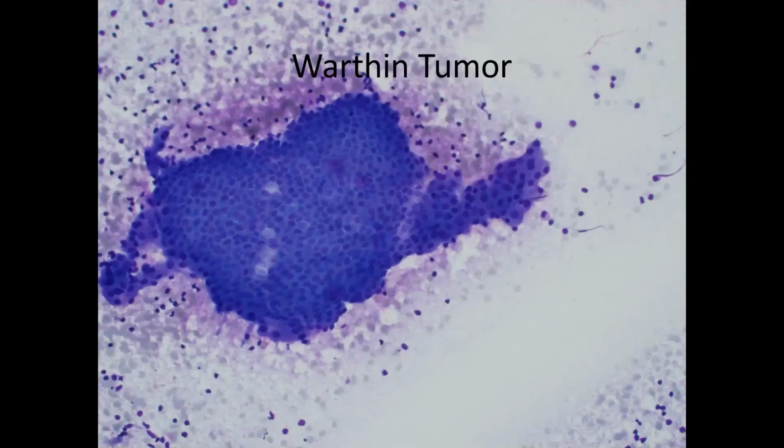I think everyone is familiar with this. Warthin's tumor, of course, has three components to it in cytology as well as in surgical pathology. Most importantly, what you want to see is going to be just flat sheets of evenly spaced out cells with abundant granular cytoplasm. The granularity is usually brought out best in the Pap stain. But in general, you want to see almost exclusively just flat sheets of evenly spaced out uniform cells, again with granular cytoplasm and inconspicuous nuclei. So that's key, the flat sheets of oncocytes.